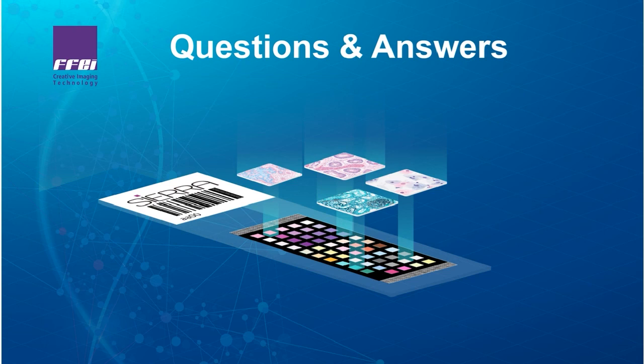So no, the slide itself is made out of lots and lots of different patches, as we mentioned in the presentation, that are stained for a whole range of the different colours that a scanner system might encounter. And so in there, there's every single part of the gamut, not of colour itself, but also the gamut of colours expected in pathology. As you will probably have seen, there's a large focus around the H&E aspects, because that makes up not just a large majority of the samples out there, but also because it's an area that needs to be quite carefully defined as a very broad stain.